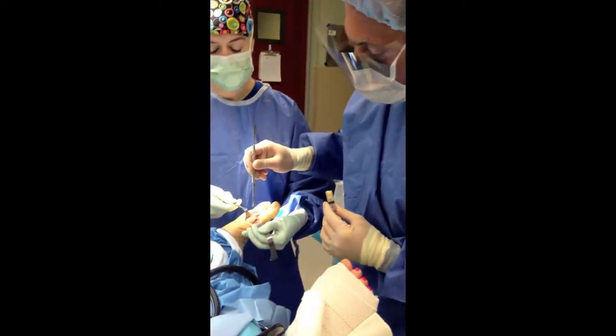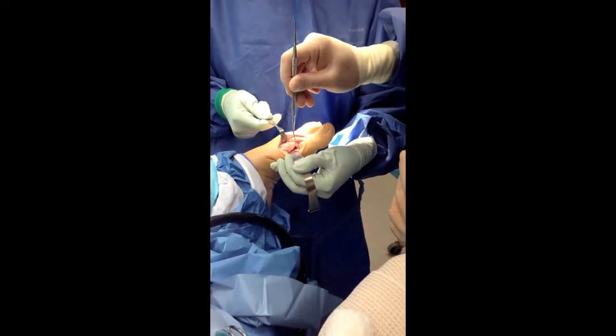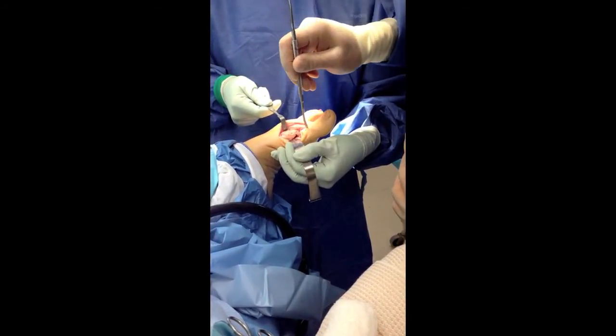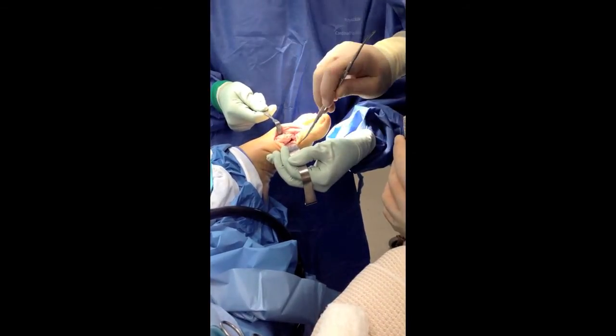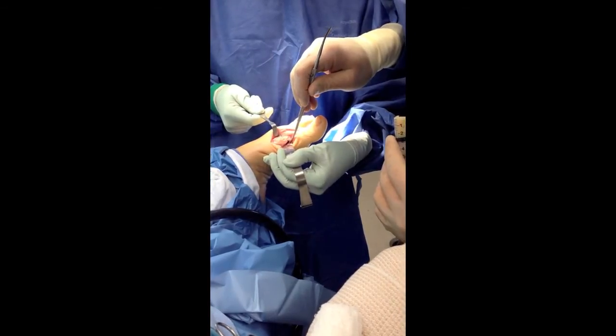What happened to this patient was there was a fracture and the head of the first metatarsal was tilted up. Now that I distracted it back in place and put in a screw fixation, there's a large gap underneath where the plantar arm had fractured away.